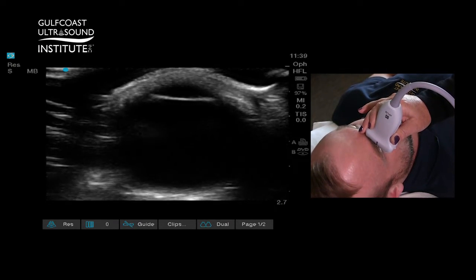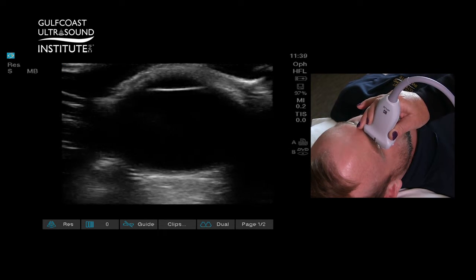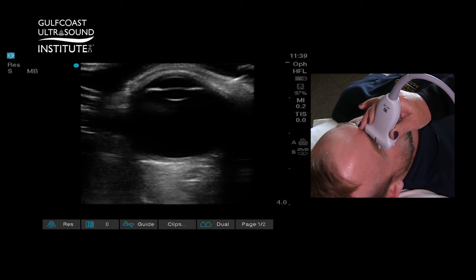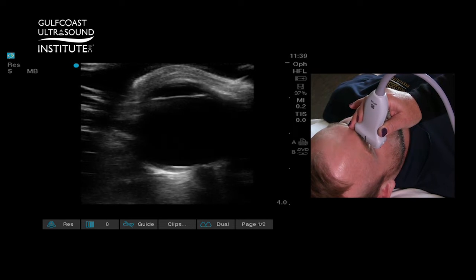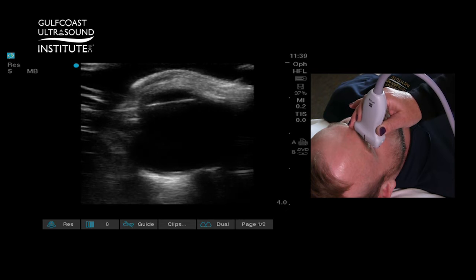When you scan the eye, increase the depth so you can see the entire globe. Posteriorly you'll see the optic nerve, and you can also see structures of the anterior chamber and the lens, including the posterior eye.